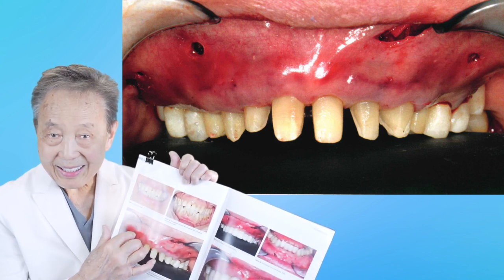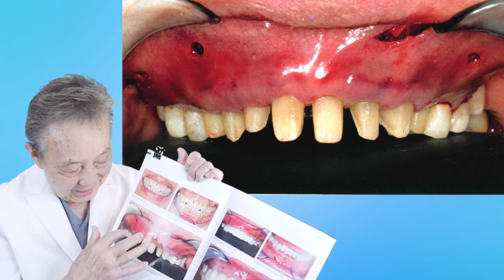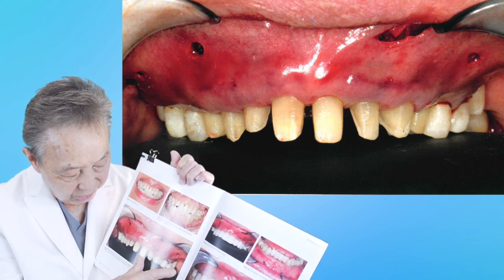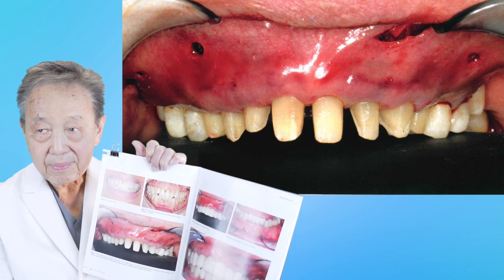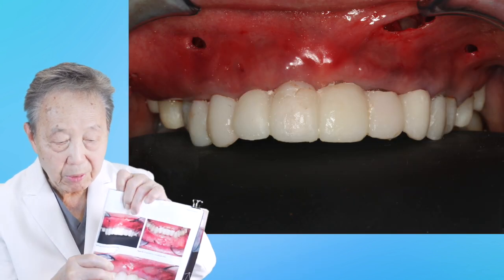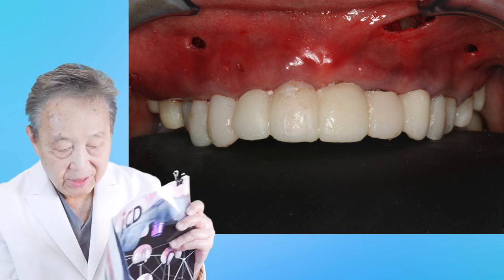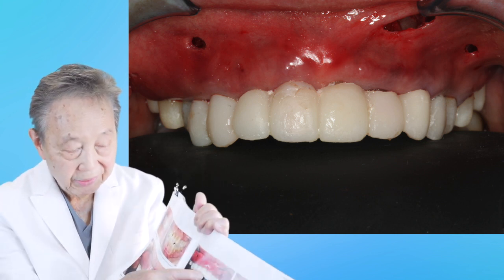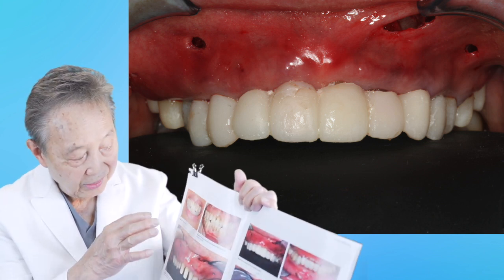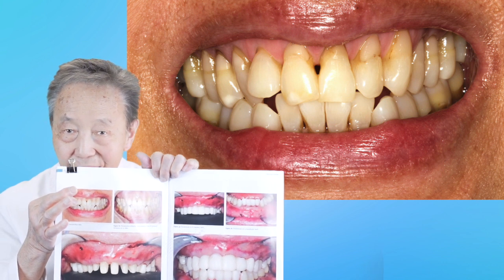With the Pinhole Surgical Technique — no scalpels, no suturing. When we finished with the surgery, it looks like this. And then we made provisionals, or temporaries, or prototypes that look like this. When she left, she left looking like this because without the holes being shown, compared to before, there was an instant change in the way she looks.